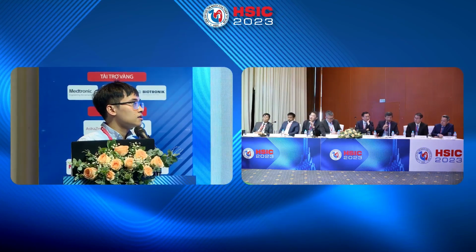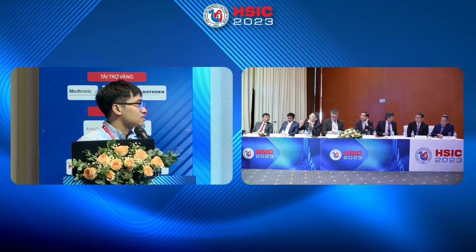Okay, thank you. Can I just make one comment? I think the most important lesson learned here is that once you finish the procedure, always look longer, because I saw that after you finished, there is contrast staining in the pericardium. So you noticed that there is a perforation at the end of the procedure. Secondly, if you know that there may be collaterals from the left coronary system, you should have done the left side to see whether there is any more dye staining there, because you have sealed off one side, but the other side may not have been sealed off. So that may have contributed to the effusion. But a very interesting case.